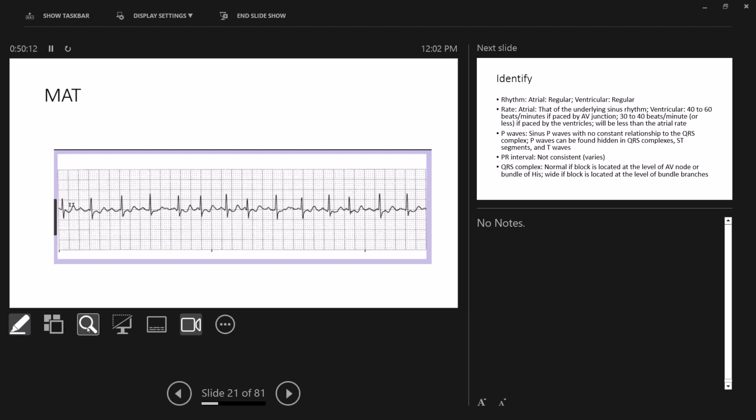This is our T wave, but we've got this and we've got this. To me, what we're seeing in here is the early formation of atrial fib. Similar right here, that's our T wave. Now we've got this and we've got this. But now look here. There's our T wave, and look, one P wave. Now it changes back over in here. And explain to me, if this is our T wave, why does it look that way?